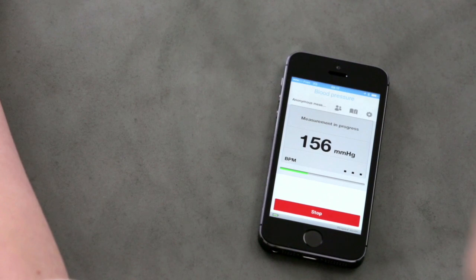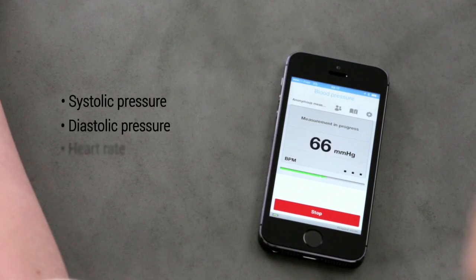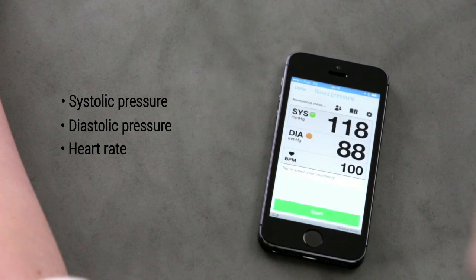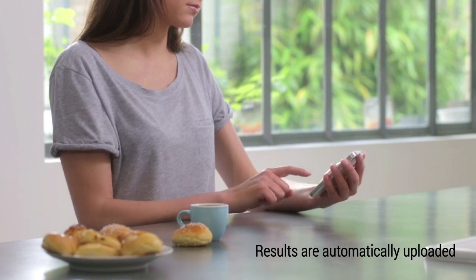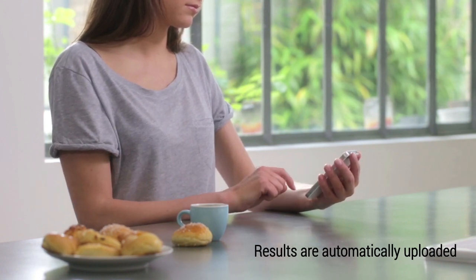Your systolic and diastolic pressures, as well as your heart rate, are instantly displayed on your smartphone. Right after the measurements, all the results are automatically uploaded to your Withings account.